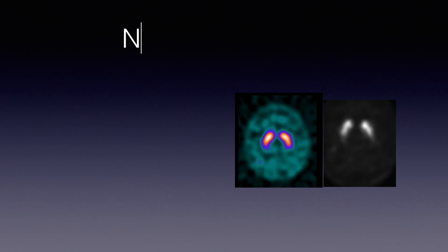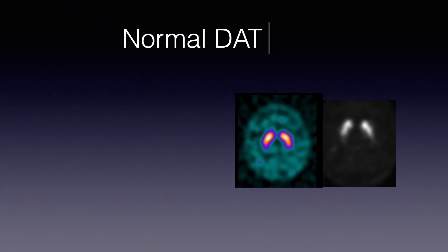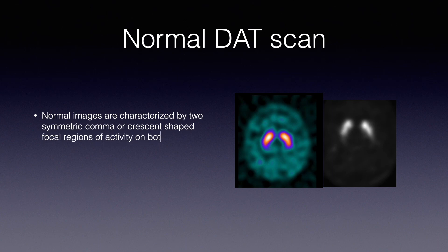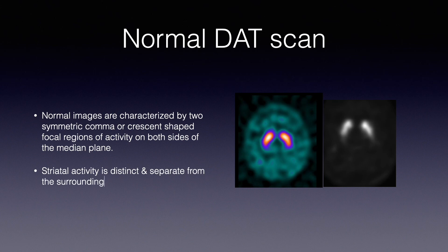The following two illustrations on the right demonstrate a normal DAT scan. The normal images are characterized by two symmetric comma or crescent-shaped focal regions of activity on both sides of the median plane. Striatal activity is distinct and separate from the surrounding brain tissue.